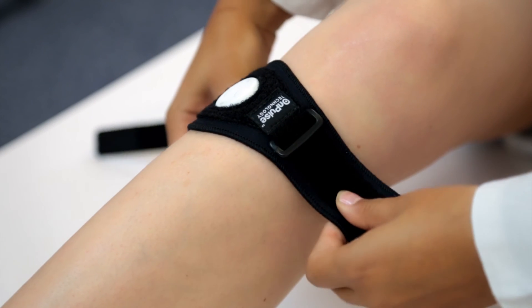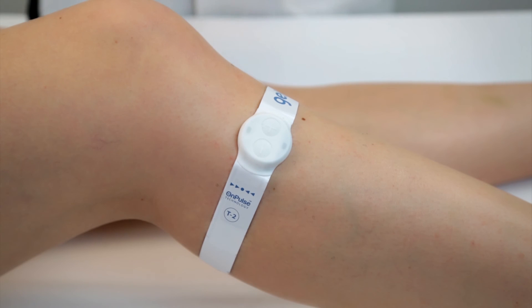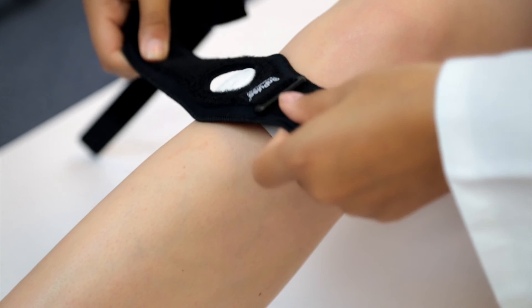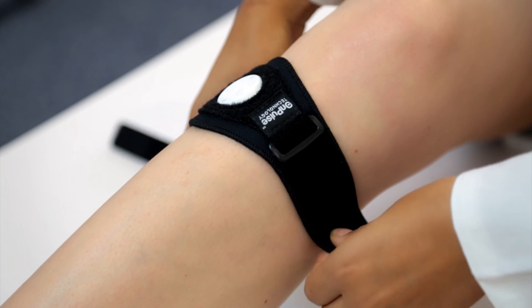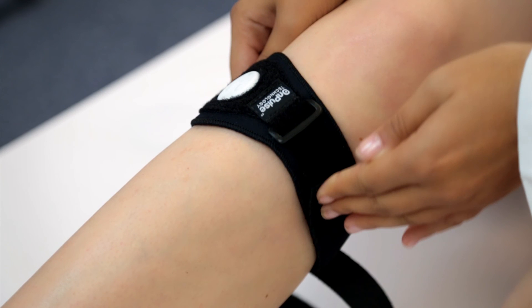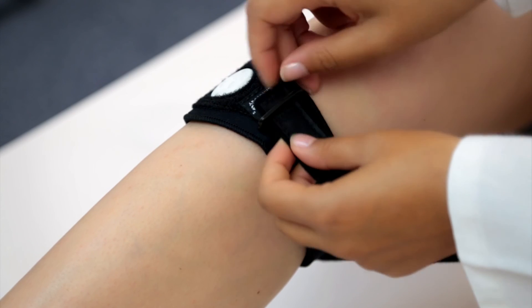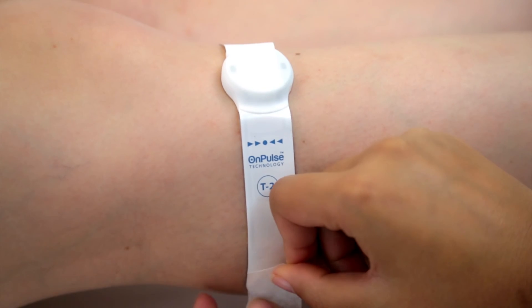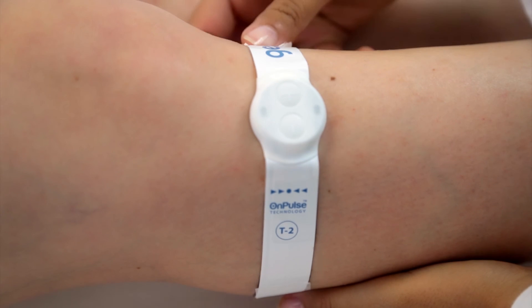For additional security of position, fit an on-pulse knee strap over the device. First ensure that the device is located correctly on the leg. Place the strap over the device with the round casing through the hole. Ensure the buckle on the short strap is positioned at the front of the leg. Take the long end and wrap it around the back of the leg and secure the main, wider part of the strap over the short end using the fastening material. Take the very end of the long strap, thread it through the buckle, then return to the back of the knee and secure with the fastening material. Alternatively, use micropore tape — apply the tape at each end of the device to hold in position.